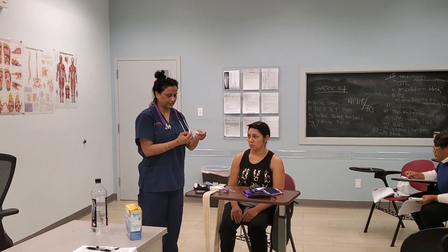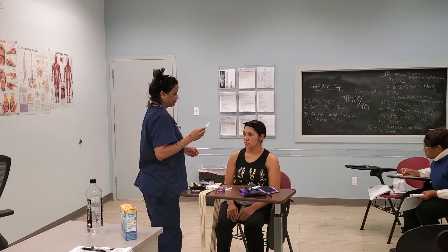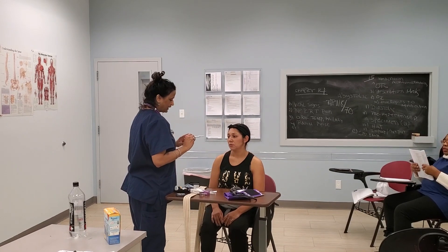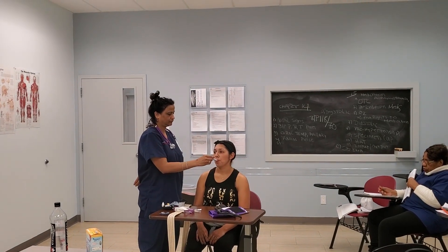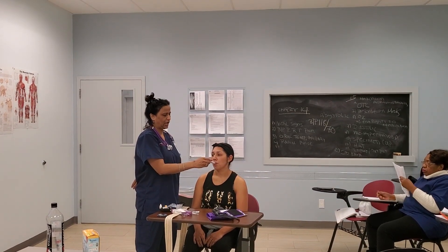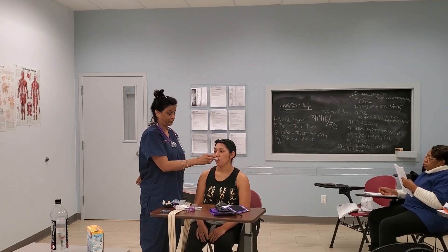I have my thermometer here — place it into a sleeve. Miss Yolanda, can you open your mouth? I'm going to place this under your tongue, and when it beeps that's when I'm going to record your temperature. Close. Hold the thermometer here and it beeps around a minute or two, and when it beeps that's when you record the patient's temperature.